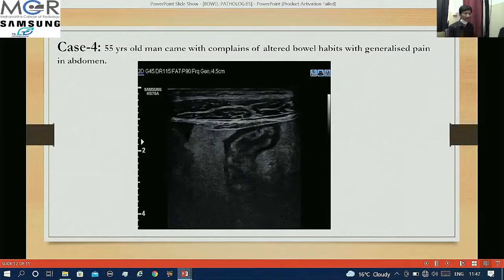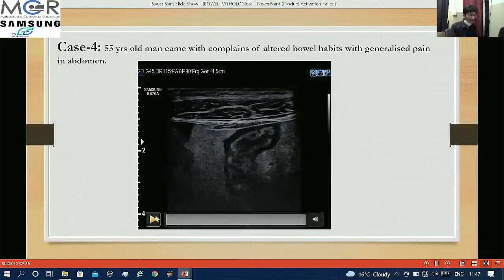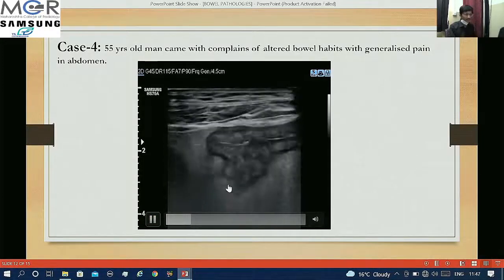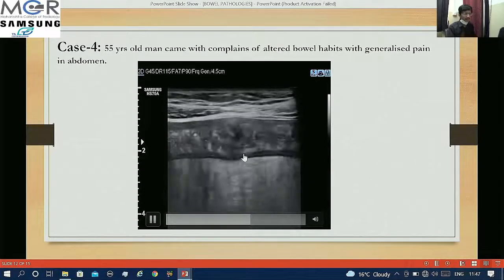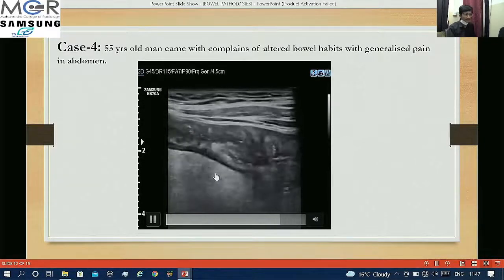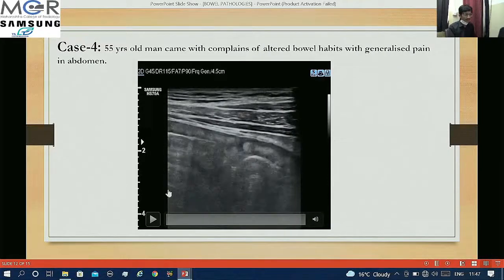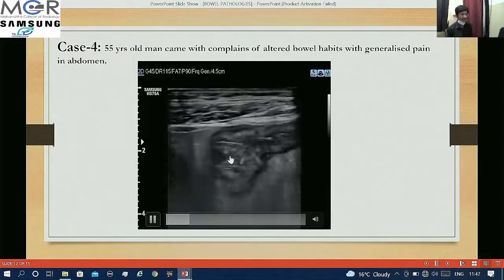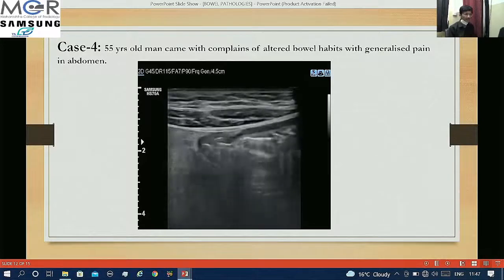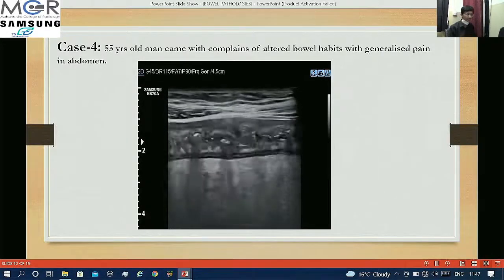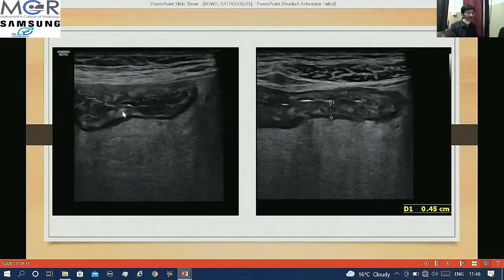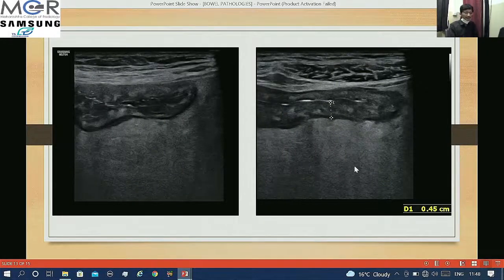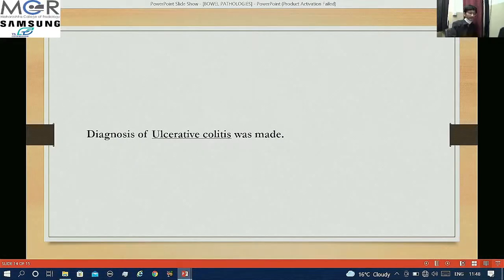The last case: a 55-year-old man came with altered bowel habit and generalized abdominal pain. On the cine-save image we are tracing the large bowel starting from the rectum, and there is continuous wall thickening involving the rectum, sigmoid colon, and descending colon with surrounding hyperechoic mesentery indicating inflammatory changes. The bowel wall thickness was approximately 4.5 mm. The key difference: Crohn's disease shows skip lesions whereas ulcerative colitis shows continuous involvement. The diagnosis of ulcerative colitis was made. Thank you.